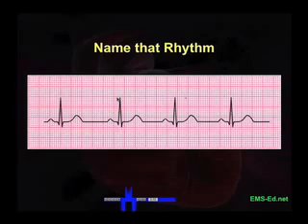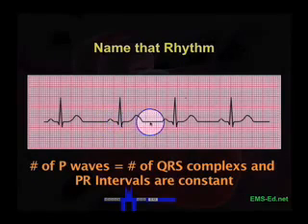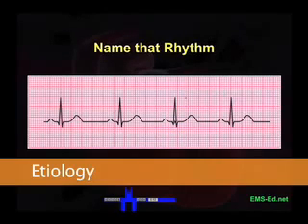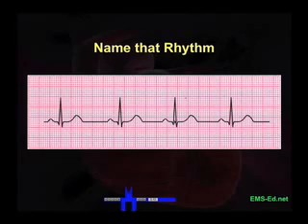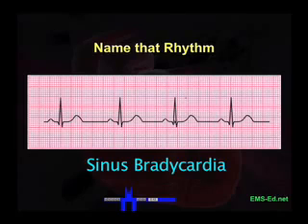It's sinus because there are P waves driving the beat, and the rate is less than 60. The P waves are clearly driving the QRS complex — sinus bradycardia. The etiology includes increased parasympathetic vagal tone, intrinsic disease of the SA node, drug effects, or it may be a normal finding in a healthy, well-conditioned athlete. The clinical significance is that it may result in decreased cardiac output, hypotension, angina, or CNS symptoms. In a healthy, well-conditioned person, however, it may have no significance. Treatment is generally unnecessary unless hypotension or ventricular irritability is present. So there you have it — sinus bradycardia.